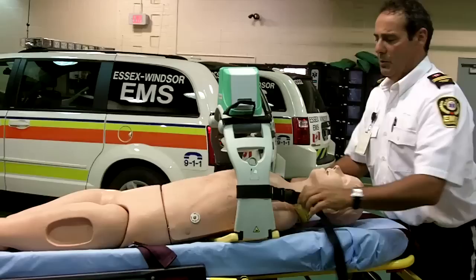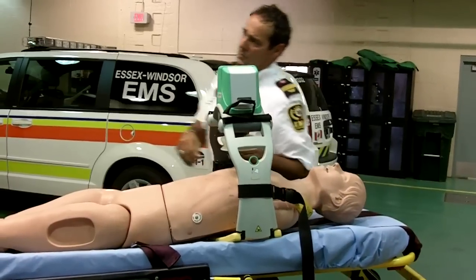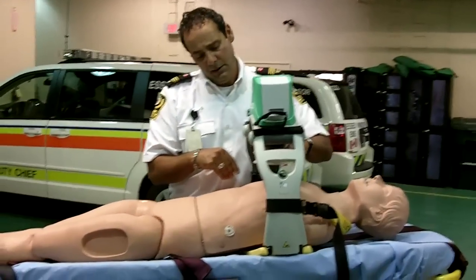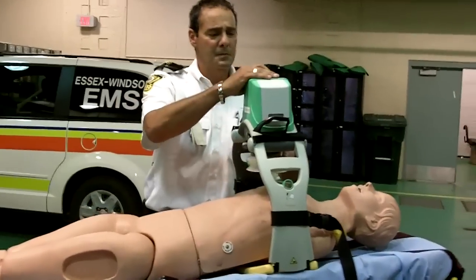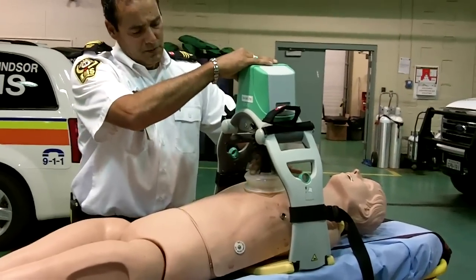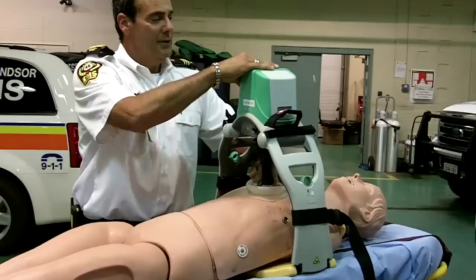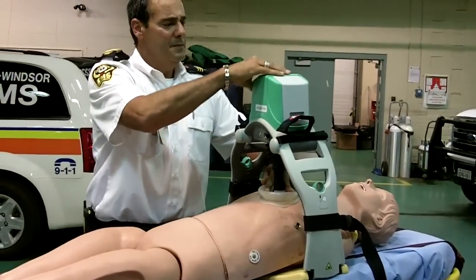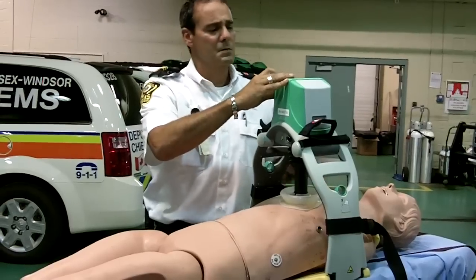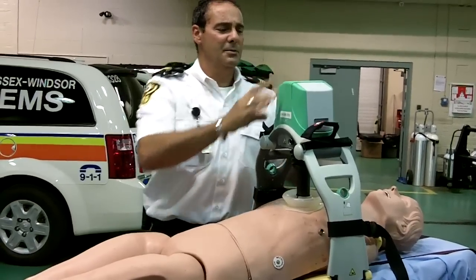We adjust it to where we want. We like the plunger just at the base of the sternum. We bring the plunger down to get it set perfectly where we want it. And it is in place.